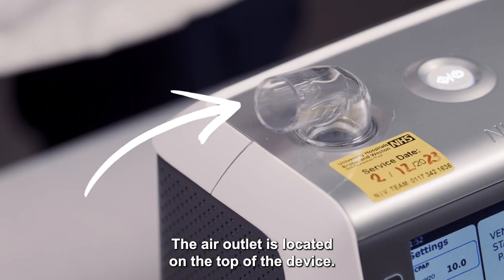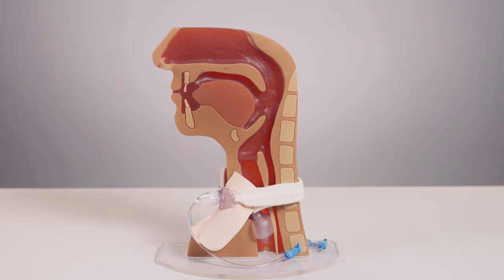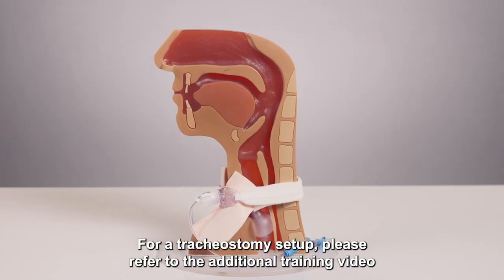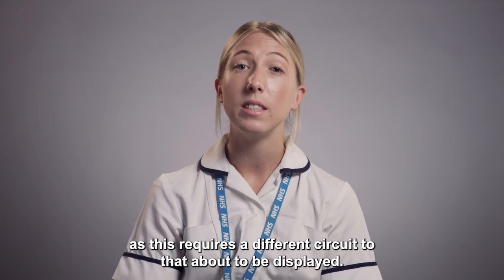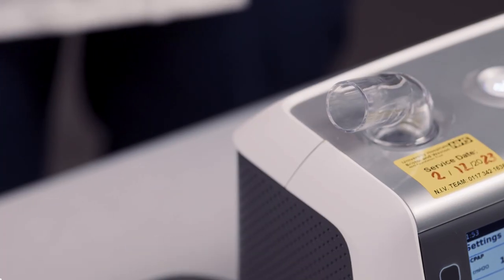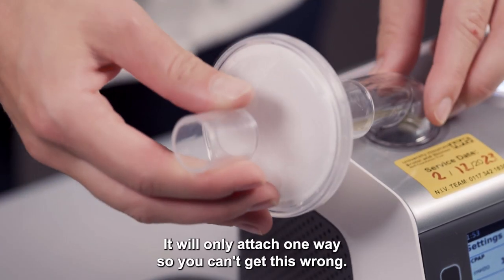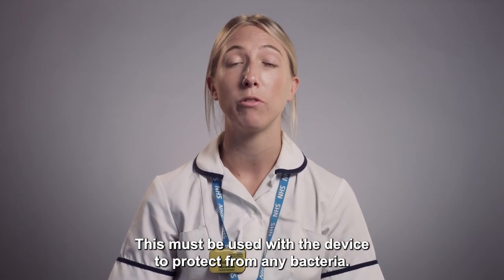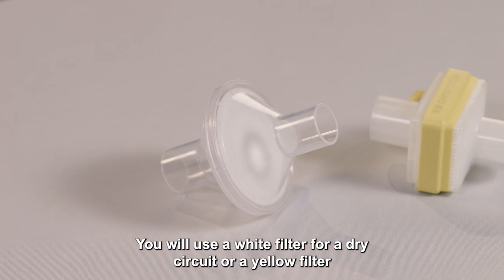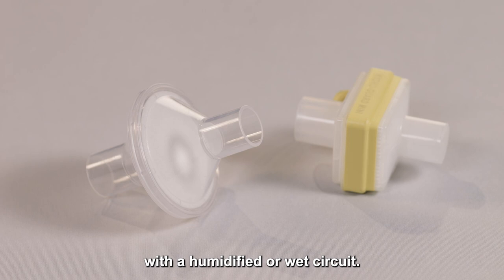The air outlet is located on the top of the device. This is where air is delivered from the device to the mask or tracheostomy. For a tracheostomy setup, please refer to the additional training video as this requires a different circuit. Attach the bacterial filter to the air outlet; it will only attach one way so you can't get this wrong. This must be used with the device to protect from any bacteria. You will use a white filter for a dry circuit or a yellow filter with a humidified or wet circuit.